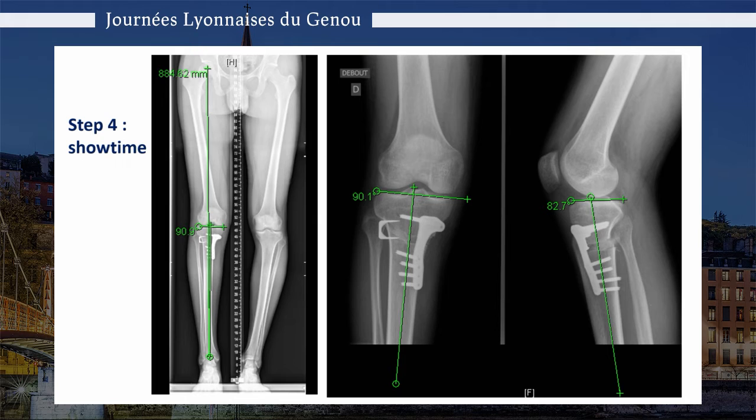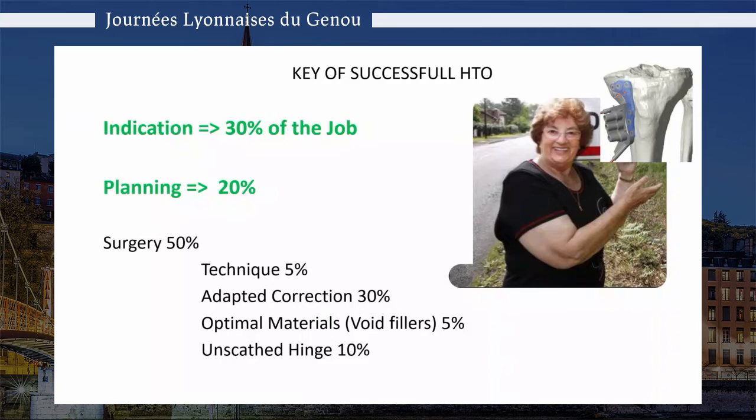I use an extra staple to stabilize the osteotomy, because to do the rotation we are completely cutting the hinge, and I like to have a double control of the bone cut when the hinge is completely broken.